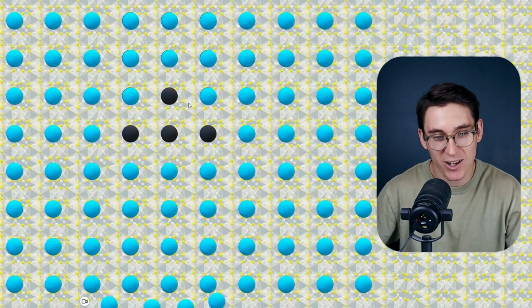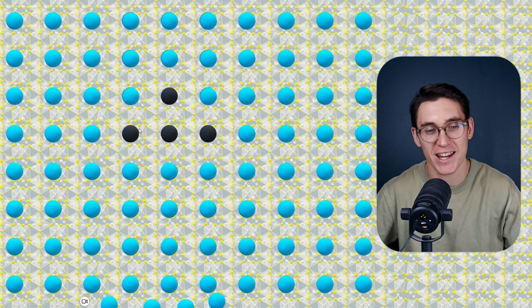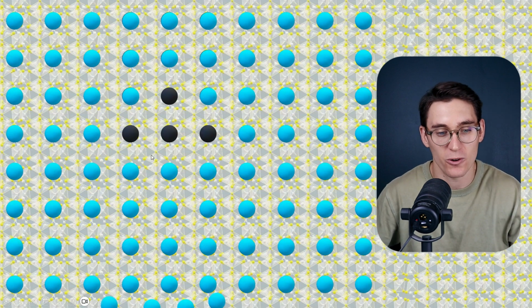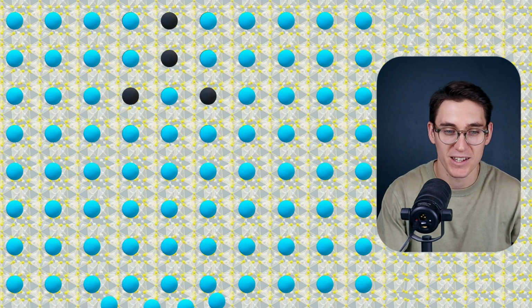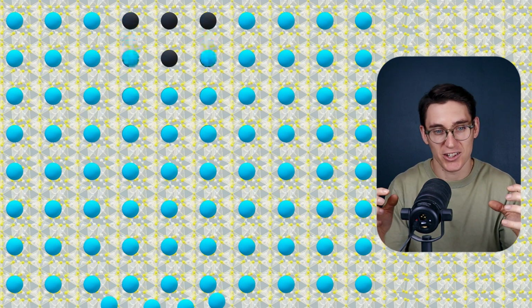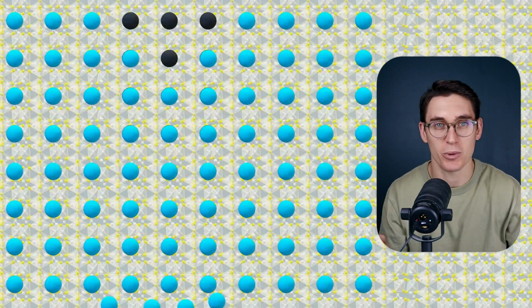Notice how that electron cloud is headed towards the anode. Now we can see the electron holes in this diagram. Which electrons are going to fill these holes? Well, because of the potential that we've created across this semiconductor layer, it's these electrons that are going to move towards the anode and fill the hole. As they move towards the anode, look how the electron holes are effectively moving towards the cathode. Now, the electron holes aren't particles themselves, they're just potential spaces. And you see now those electron holes have moved towards the cathode, ultimately creating that electrical pulse.